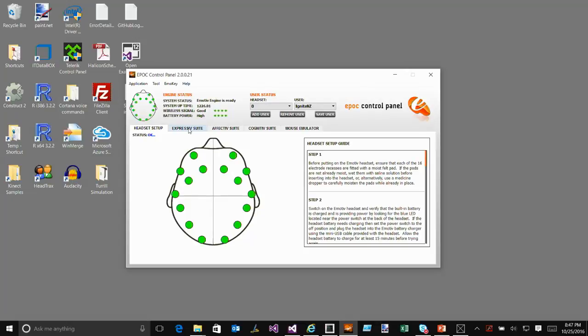First of all, you can see there's a whole bunch of green little dots right there. Those green dots on the head, that's actually a diagram of the head. That thing at the top that sticks up is the nose. So you're basically seeing my head like this, the top-down version of it, with the nose sticking out and the two ears on the back. And right now, they're all reading with full signal strength. That's why all of them are green. So everything is good right now.